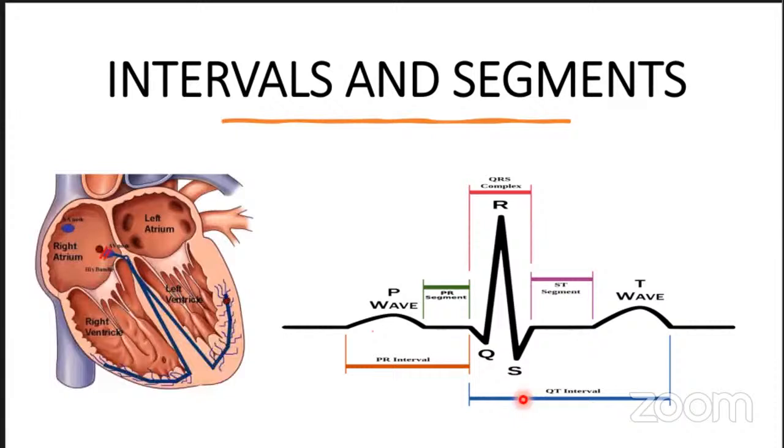Again, how do I remember it? I just think of the cal in front of calcium. So that's cal 911. I remember that my calcium should be between 8.5 and 10.5. If my client's calcium level is less than 8.5, the QT interval may be prolonged. There are other things that can also cause it, but that's one very important one you want to know for the NCLEX.